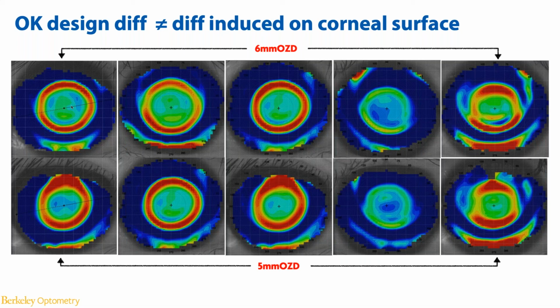And another practitioner is actually looking at the slide you have up now, and they have a question about the images, the fourth image in both rows. They're wondering why this image looks completely different from the others. So this subject, number one, she had a flat cornea to start with. And so I try to use normalized color scales. Each vertical pair is using exactly the same color scale, but across the board, they're probably using different color scales.